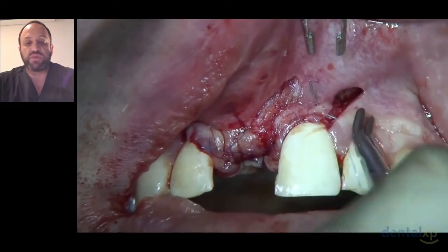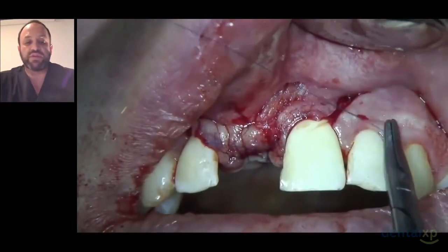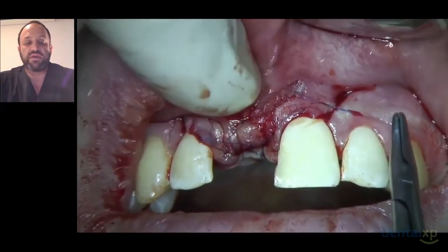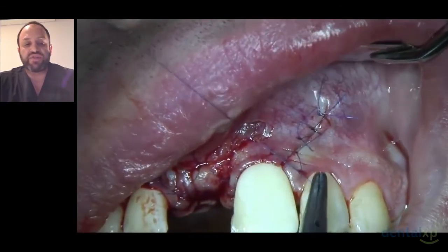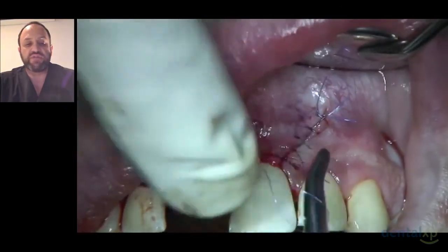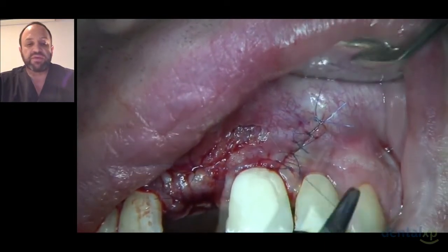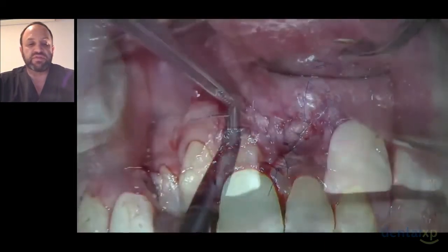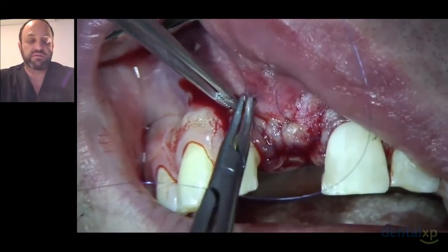Obviously, when one sutures the margins of these type of releasing incisions, it does tend to pull a little bit on the area, so they're not as passive as one would want. And just generally, I keep away from the top and just slowly suture everything together so that everything comes together very, very nicely. And here you can see the releasing incision sutured very, very nicely, and doing the same on the other side. Nice, simple interrupted sutures here.